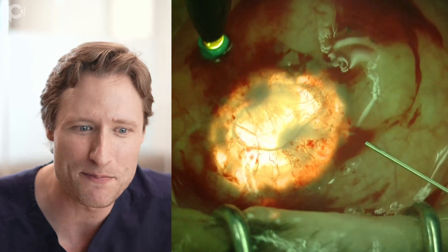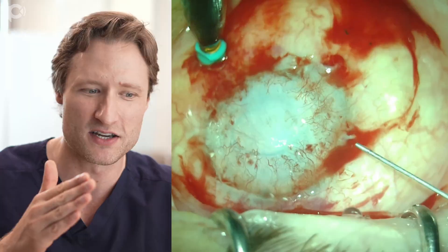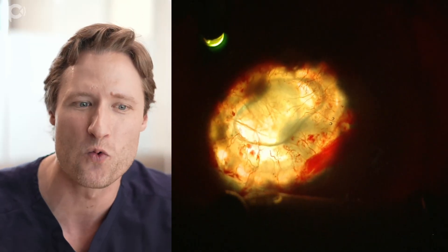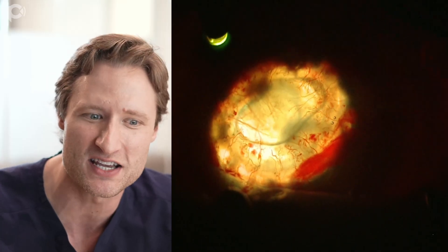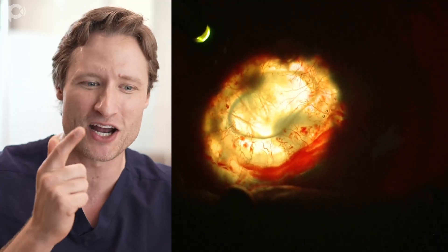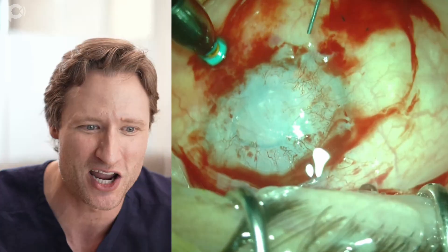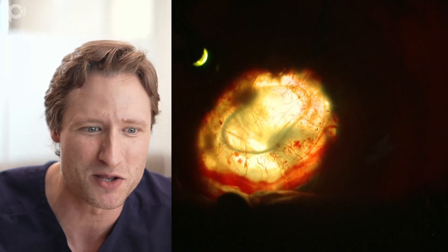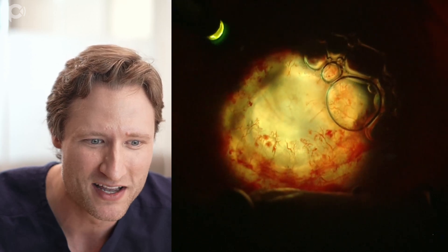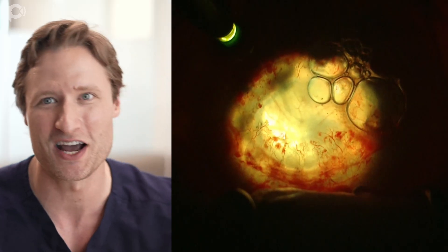What I decide to do is rather than inject from that paracentesis, move my angle of attack up to where the anterior chamber maintainer was, which is in closest vicinity to that bubble. I'm going to move up to where the bubble is and inject basically directly into it to expand the bubble and inflate the anterior chamber. I turn the microscope light off so I can see what I'm doing, then inject directly into the bubble, and that inflates the anterior chamber and pressurizes the eye. And that's the end of the operation.